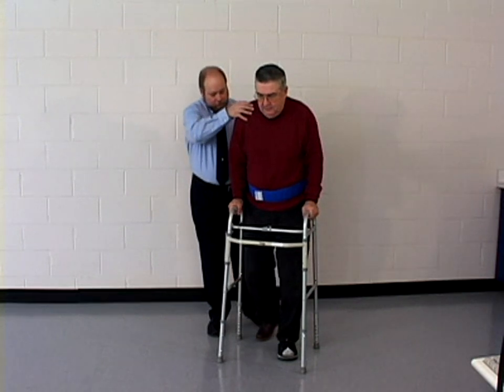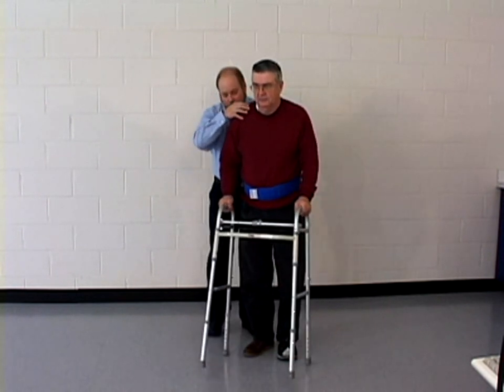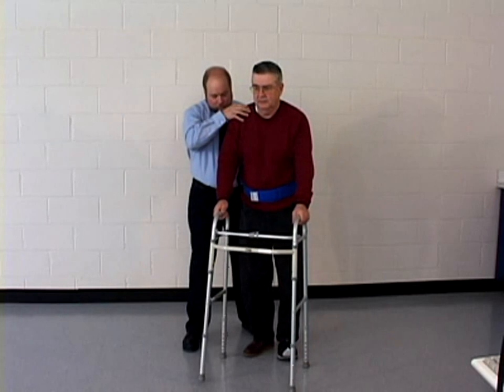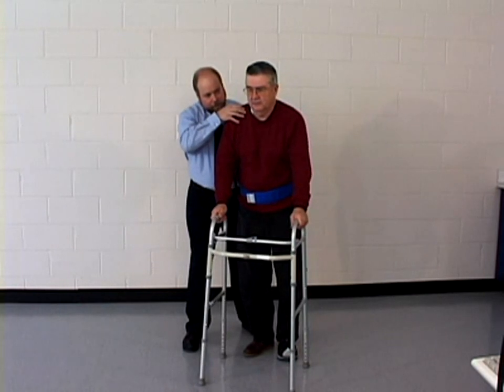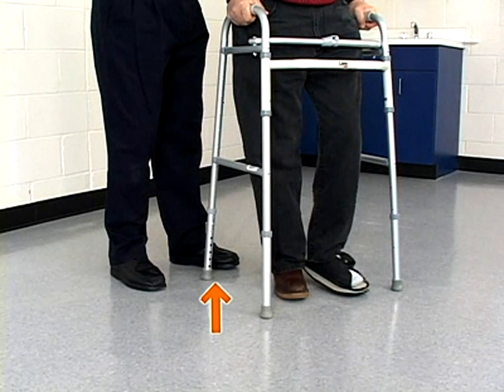He may step to or slightly beyond his other foot, but not beyond the front crossbar of the walker. Equal step lengths should be encouraged. The therapist advances his left or inside foot to move with the patient.